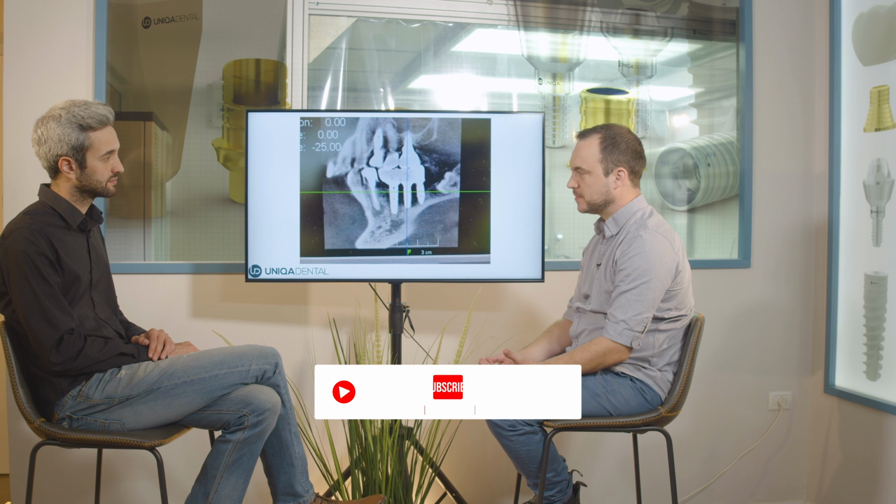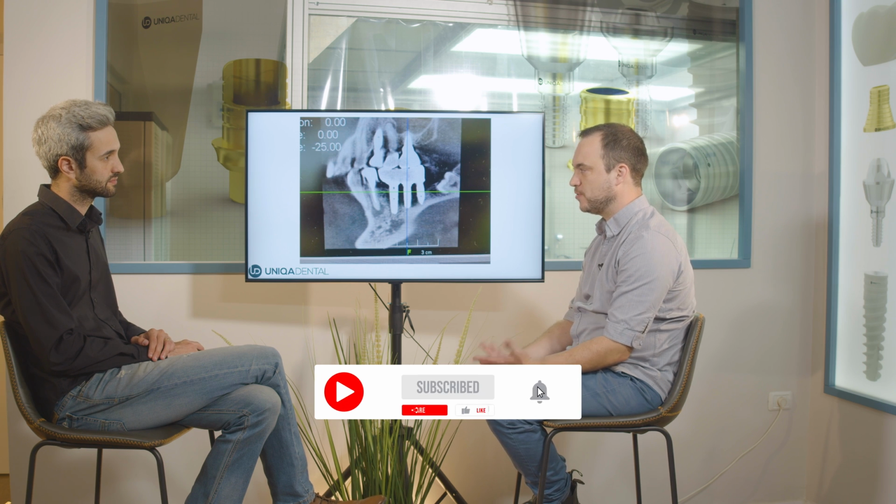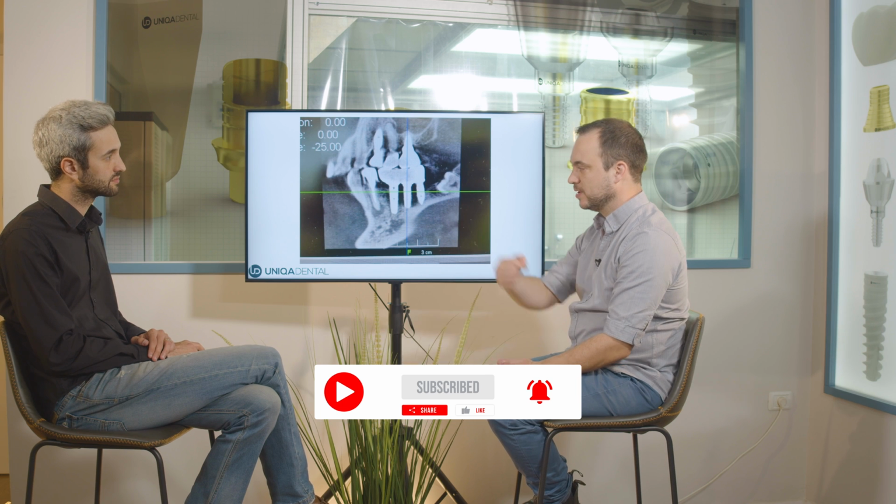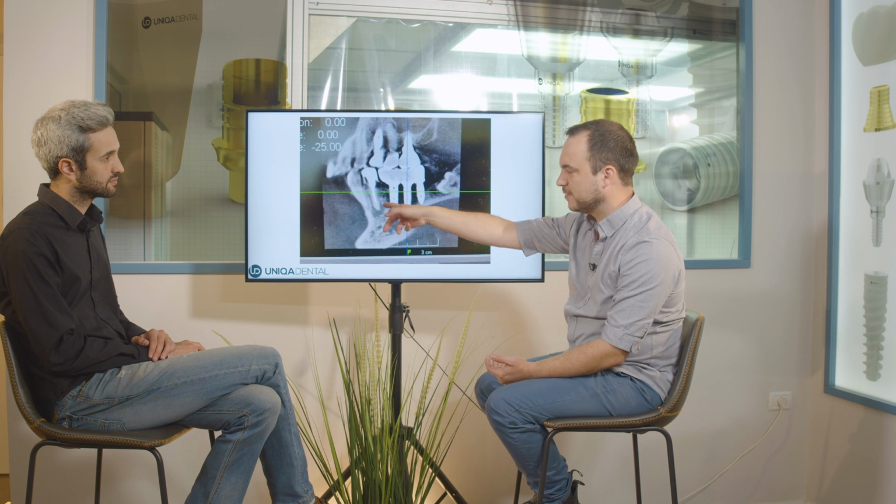Today we have a case where we already have a bridge on implants and we have a problem with the proximal tooth on this tooth. We can see that we have some inflammation, we have a periapical lesion. Probably there is some caries that we don't see on these x-rays. So we need to extract the tooth. And now the question is how we want to restore the tooth.